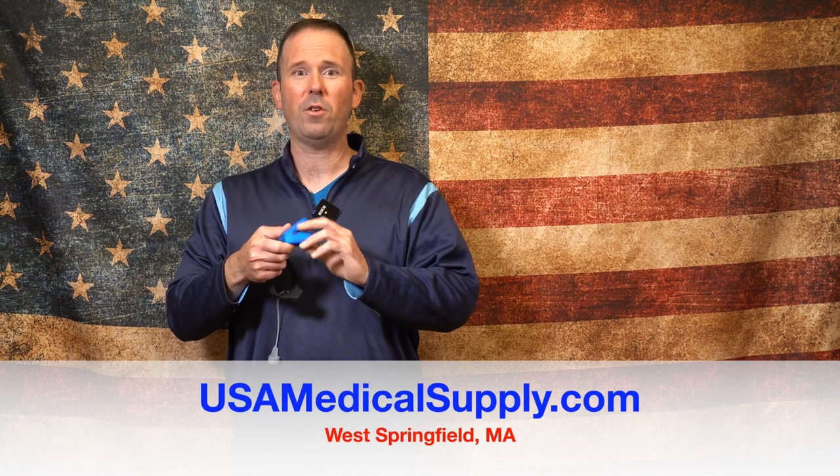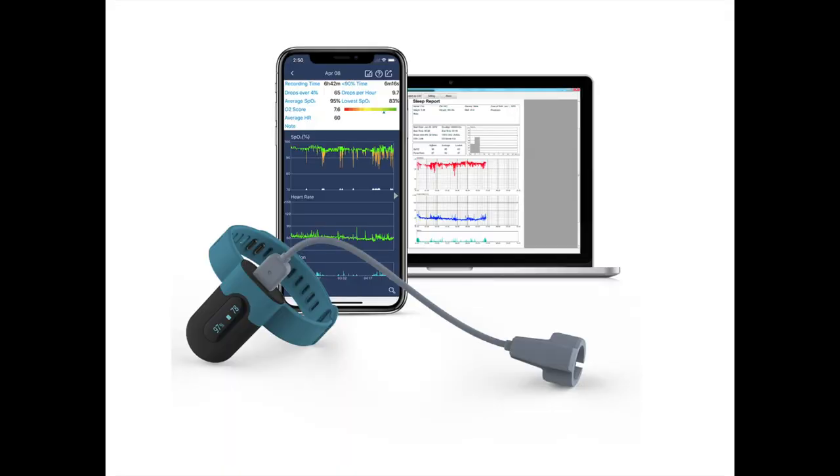The $25 one like this you see will not work. You'll have to use something that looks like this that continuously saves your data as you're sleeping through the night — this is the one I use personally. I download the app on my phone and I'm able to see my heart rate and also my saturation levels throughout the night.